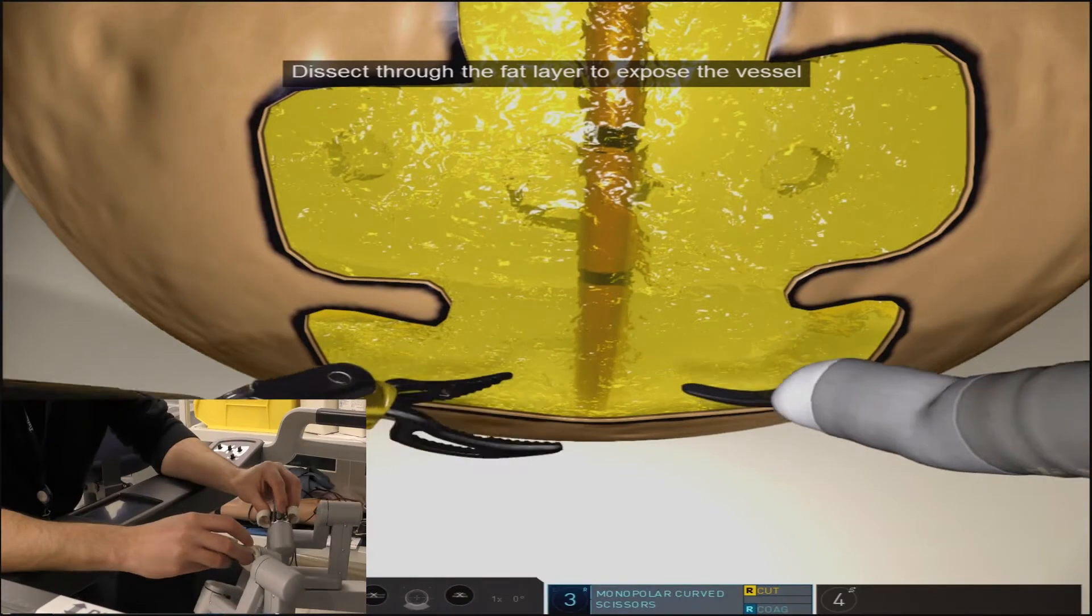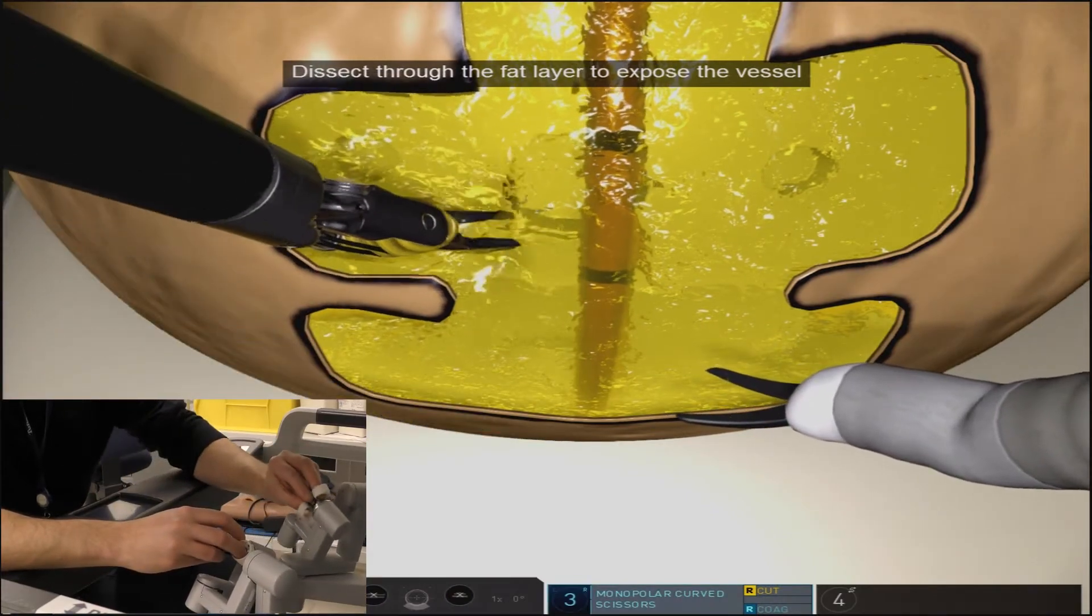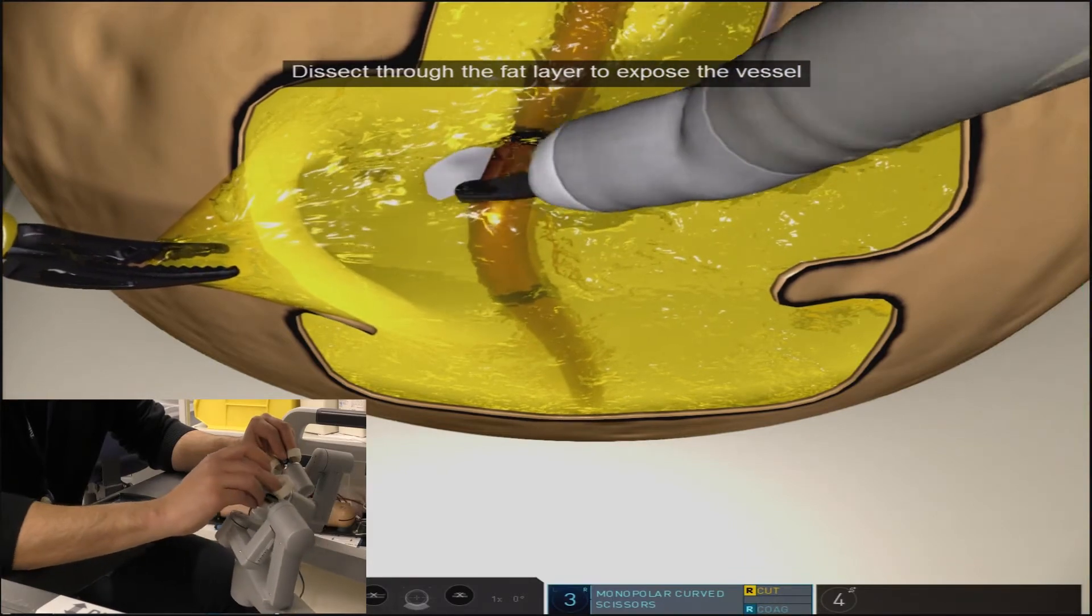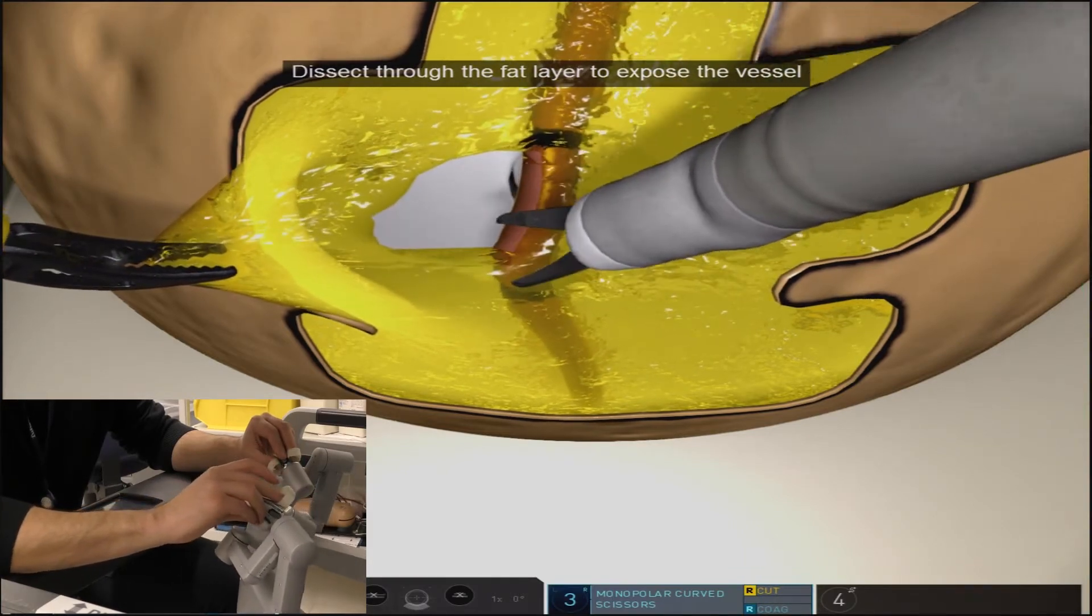Similar to the energy pedal exercises, your left hand has a grasper that does bipolar coagulation and the right hand has scissors that can do monopolar cut and coagulation.